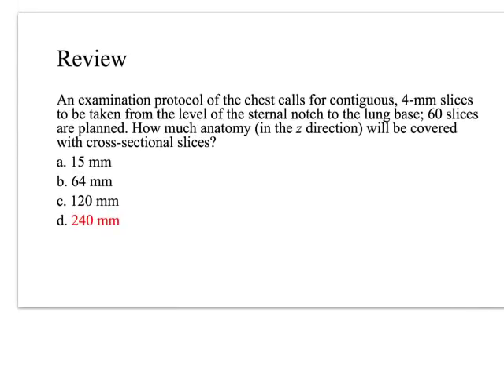All right, good. How did they arrive at that? Let's work it out. We've got 4 millimeter slices, right? And we've got 60 slices that are planned.